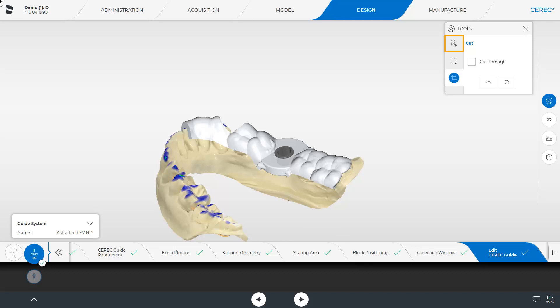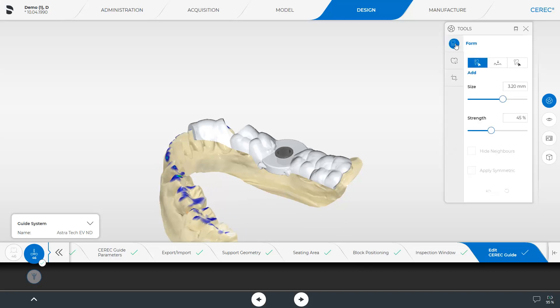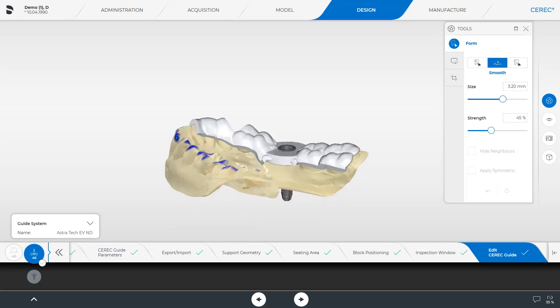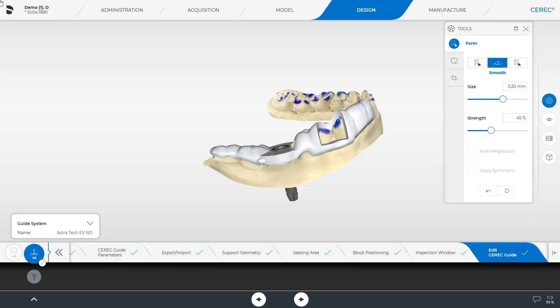Now, we enable the Form tool, where we can select between Add, Smooth, and Remove. For demonstration purposes, we will smooth the cutting edge on the lingual side. We will not smooth the previously marked cutting edge in the anterior area, because this way it's easier to detect the transition between guide support and tooth structure.